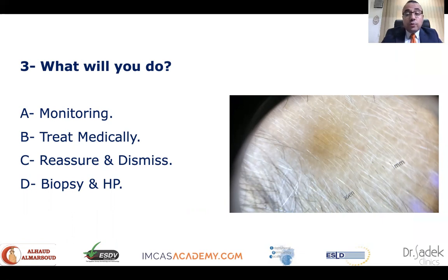And in order to know what we will do, we'll need to reach a diagnosis. So what do you think of this case? This boy has been suffering of patchy hair loss dating since birth. On the temporal region and on dermoscopic image, we can see just vellus hair all around. No hypotrichosis, but vellus hair is occupying the full area. And this is pathognomonic for the diagnosis of temporal triangular alopecia of the scalp, yes.